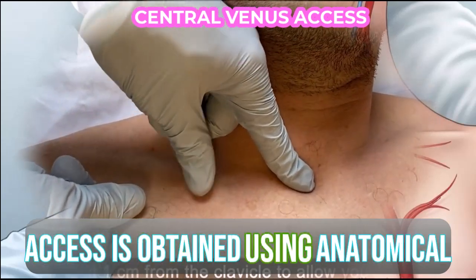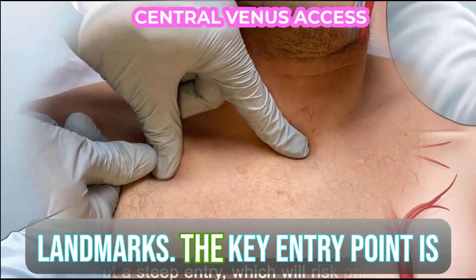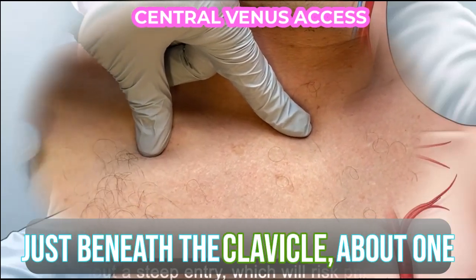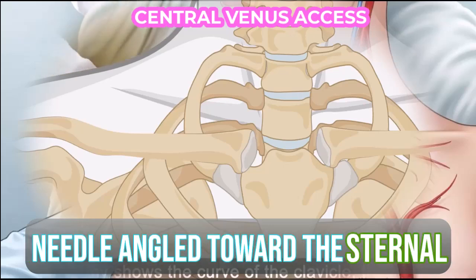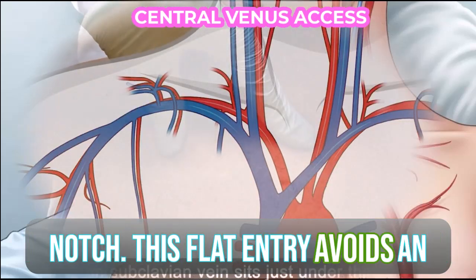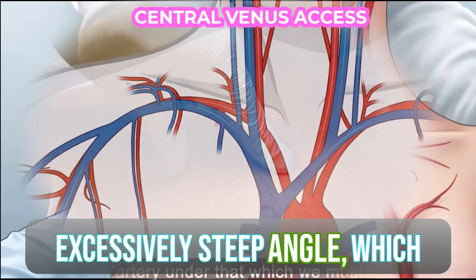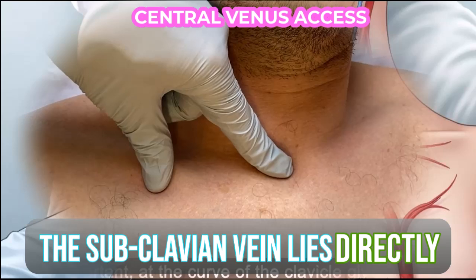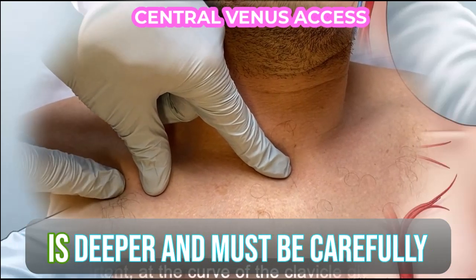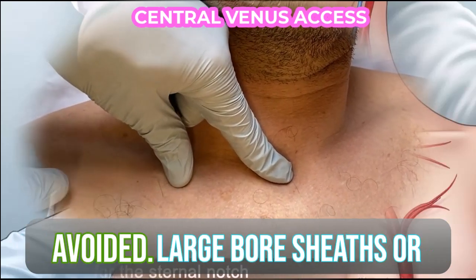Access is obtained using anatomical landmarks. The key entry point is just beneath the clavicle, about 1 centimeter below its curve, with the needle angled toward the sternal notch. This flat entry avoids an excessively steep angle, which increases the risk of pneumothorax. The subclavian vein lies directly under the clavicle, while the artery is deeper and must be carefully avoided.